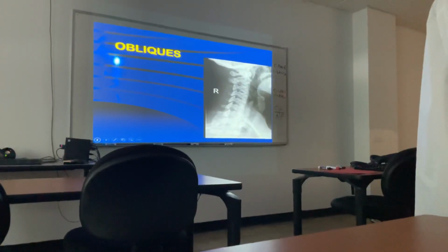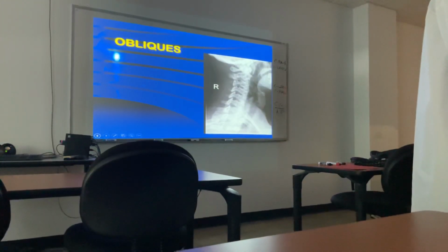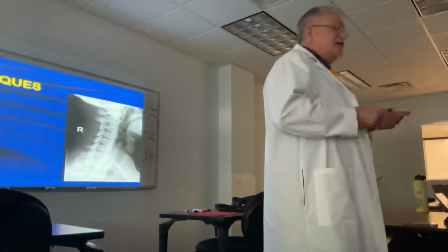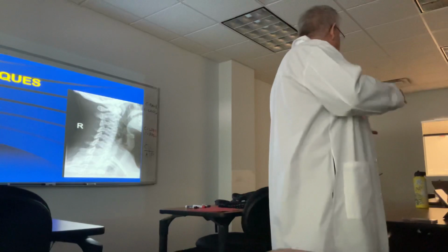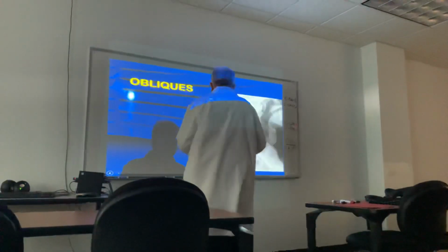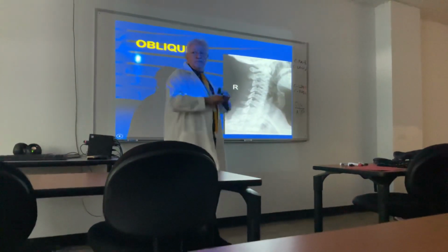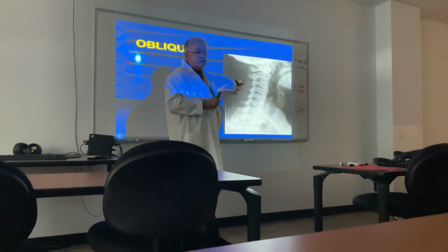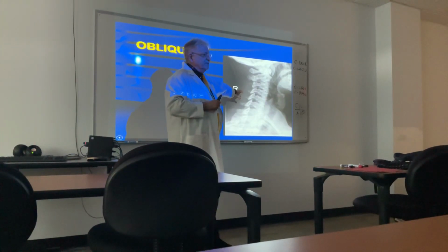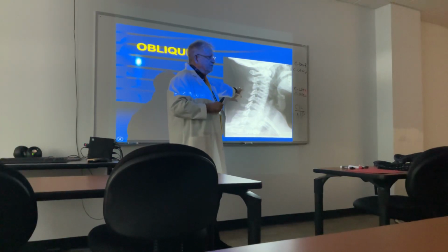Now, it's your job. Who's doing the radiology report? The CA or you? Us. Okay? If you get this part incorrect and it's the right IVF when it should have been the left, that's all on you because you're signing the paper. Now, with the computer setups and the digital x-rays, they can put this R on after the fact. It's a computer, just put it on there. Is it possible that your CA does it incorrectly? Yep. Whose office is it? Yours. It's all on you. Now you may have to retrain them.